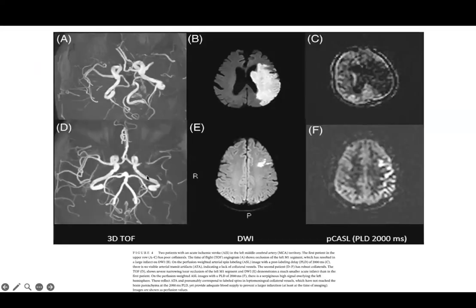And here we have a patient who has a left MCA occlusion. This is the infarcted zone, which is not showing any hyperintensity signals in the ASL mapping. But here we have a left M1 MCA occlusion in a patient showing a small infarct, but the patient is having this peripheral serpiginous enhancement, which is indicating slow moving blood, showing arterial transit artifacts.